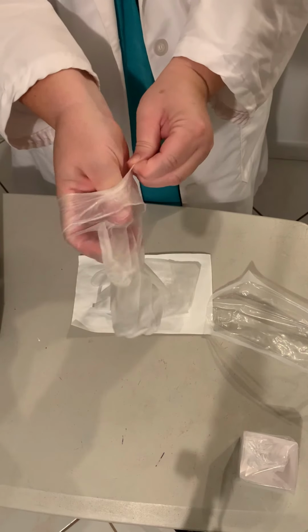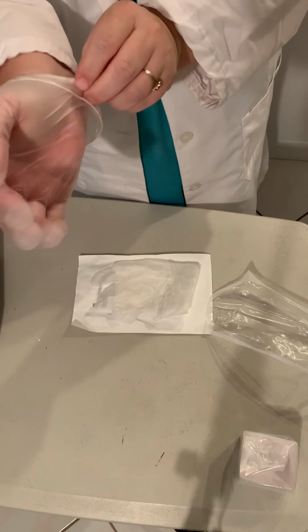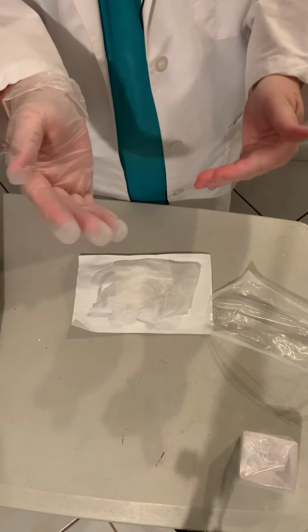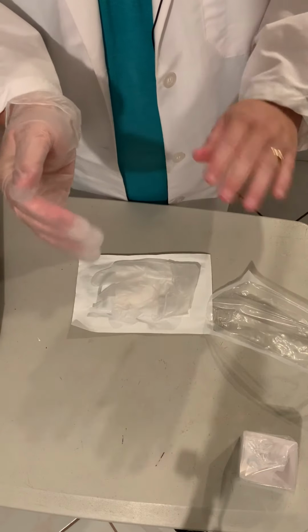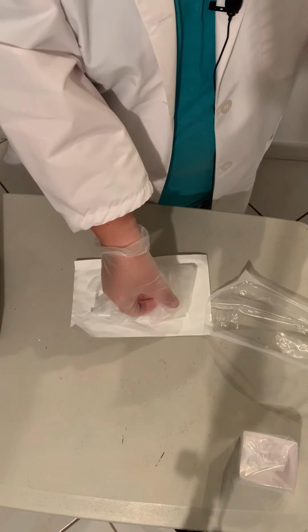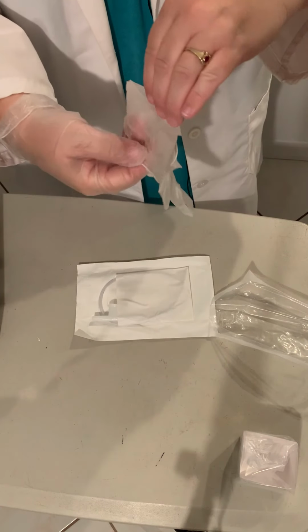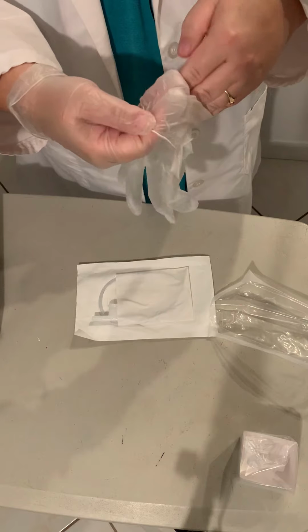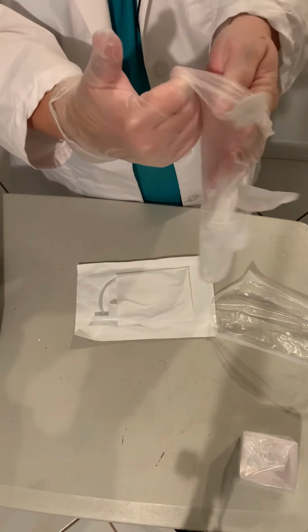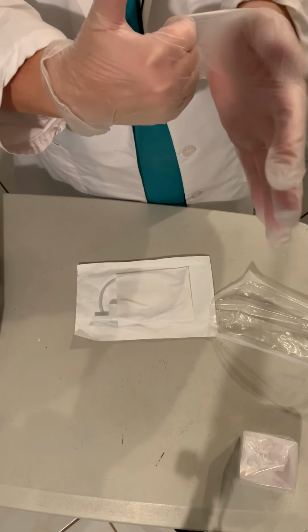So now we can put this on. And some people, before they open the package, will kind of do that with the package, and that can loosen the gloves up. But be careful, because that also loosens everything else in the package so it could slide around. So we're going to pick these up carefully because it's so easy for them to hit the edges. Okay, so slide these gloves on.